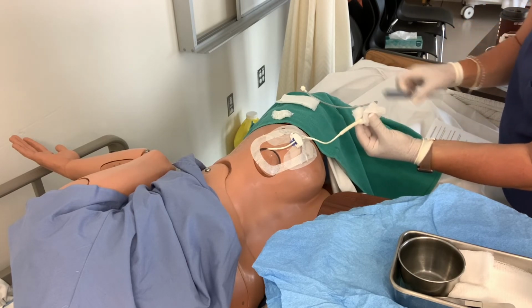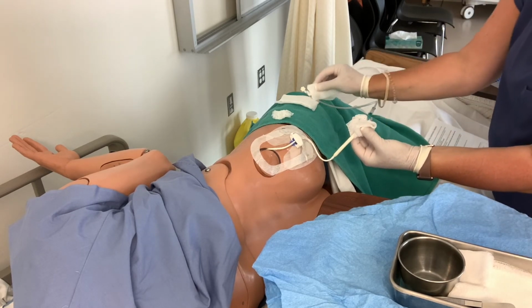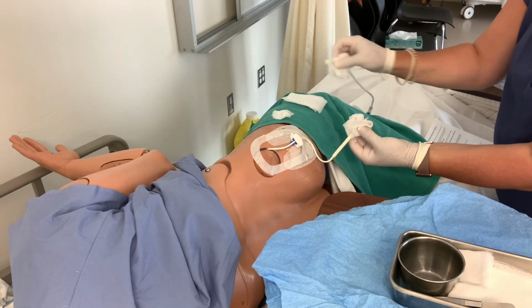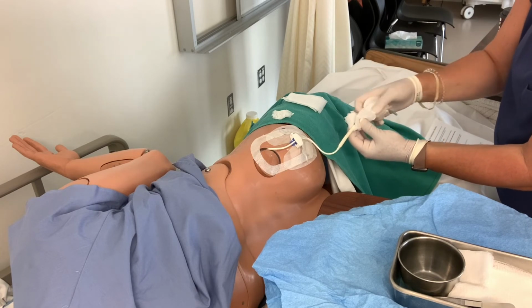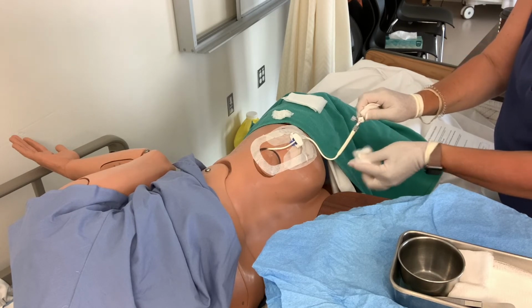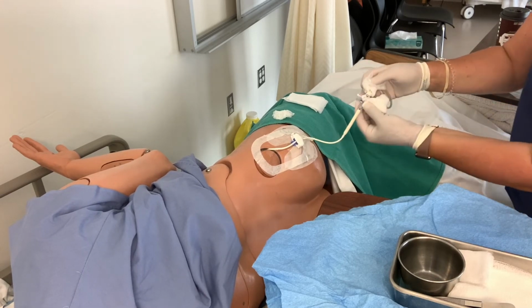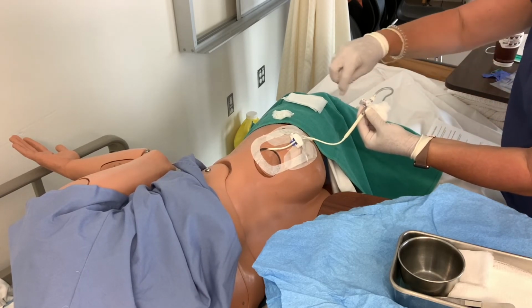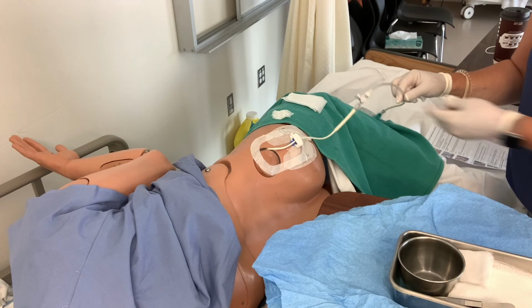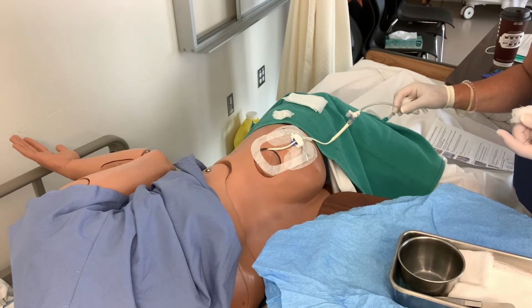This has been inserted, so this is no good. And now I need to reach back and grab my gauze that has been sitting up here on a sterile gauze, grab the tubing that's been sitting on a sterile gauze, and it gets put back together. Screw it on tight. Make sure your connections are tight, and then turn your stopcock to the on position so that the fluid is not going to come out this hole, it's going to come in here and go through here so that your highway is clear and it will drain into the bag. So it's not a huge procedure, a flush, but it does require strict sterile technique.